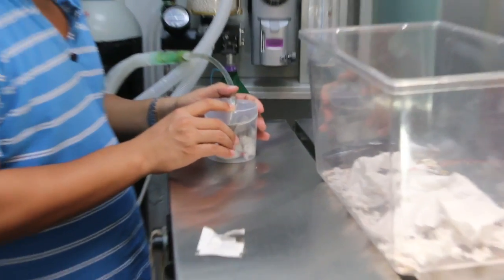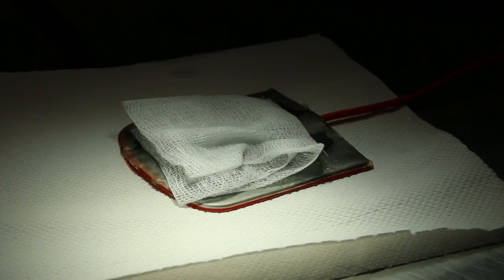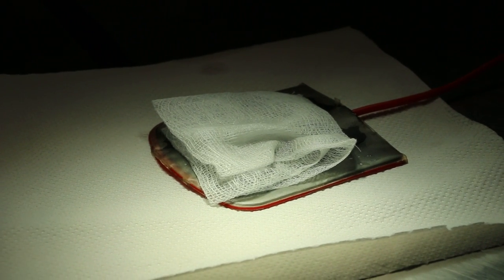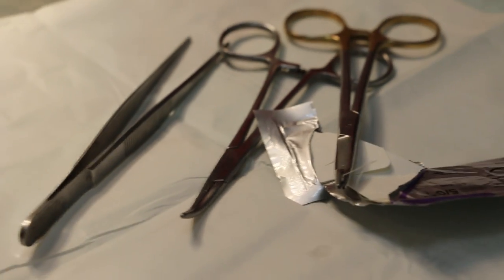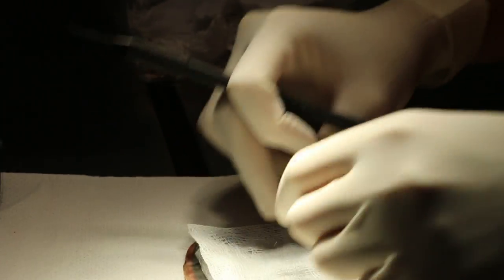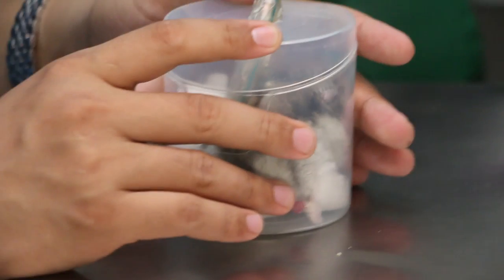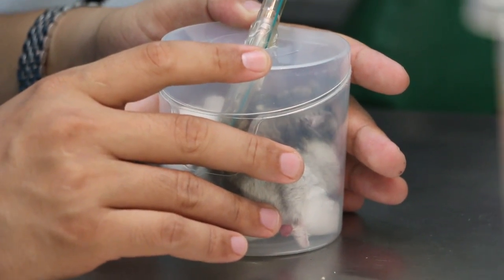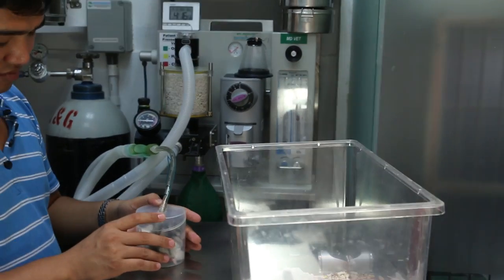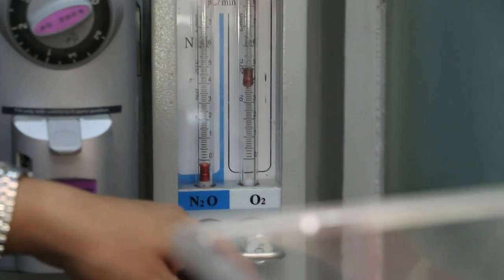See, once the hamster stops moving, then you put on this electro-surgical pad and then excise and stitch. Everything is ready. Planning ahead first. Okay. Still quite strong. Still moving. 5% isoflurane. Oxygen flow.